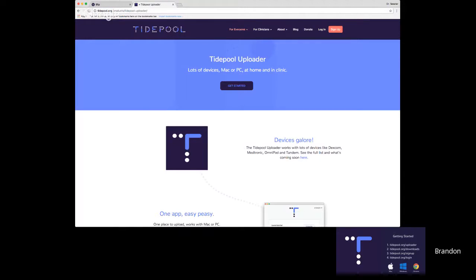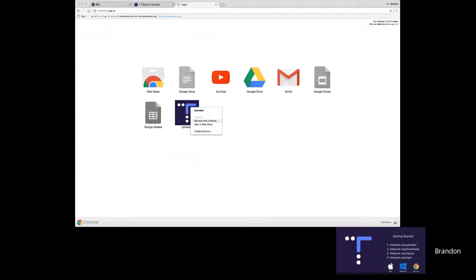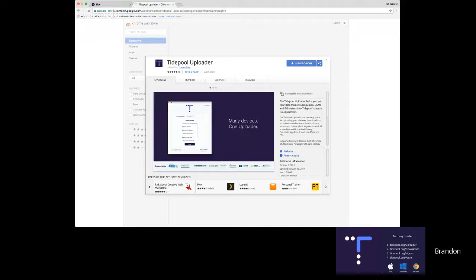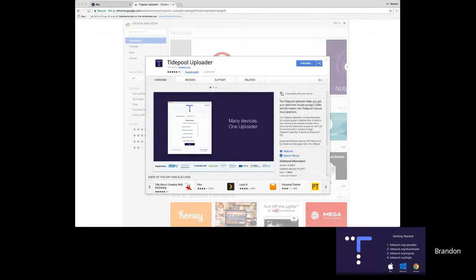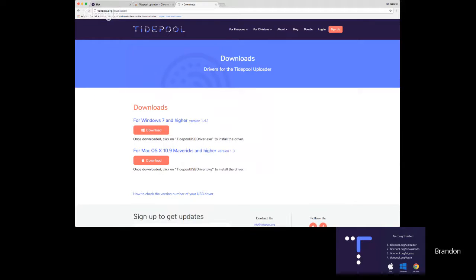The first thing you want to do is get the Tidepool uploader. From tidepool.org/uploader, click Get Started. This is happening in the Chrome browser, which allows you to add the Tidepool uploader as an app. Installation is done. The next thing is to get the Tidepool driver at tidepool.org/downloads — there are two options, one for Windows and one for Mac. You only have to download and install this driver once, and then you're good to go. The Tidepool uploader then has what it needs to communicate with any devices you might plug in.